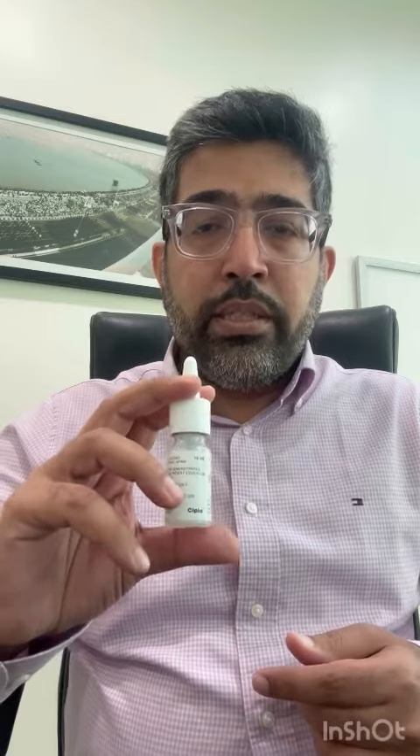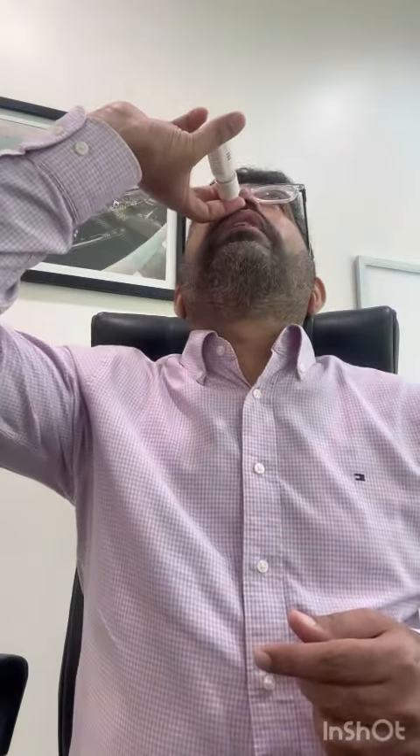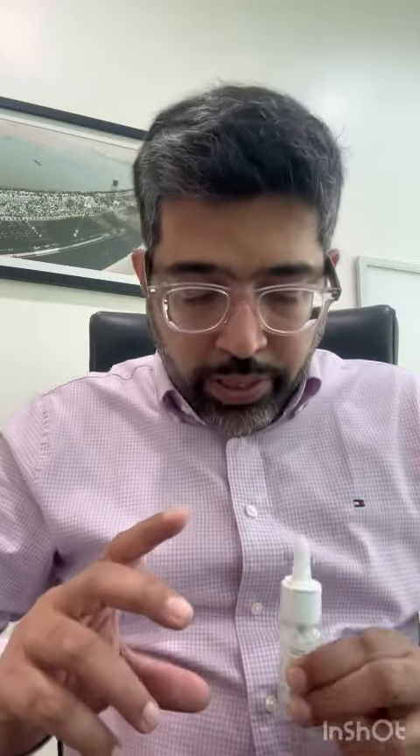Also, this spray only works in a straight, upright fashion. If you put your head up and use it that way, or use it lying down, it just won't work. There are a few sprays which work in any position, but the best way is with your head down and spray straight, so that it reaches the entire nasal cavity.